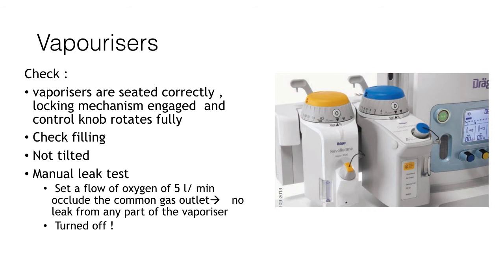You should also then complete the manual leak test. This involves setting the oxygen flow to 5 litres a minute, occluding the common gas outlet, and assessing to see if there is any leak from any part of the vaporizer. If a leak is present then the flow bobbins would dip. Finally before moving on, you need to check that the vaporizers are turned off.